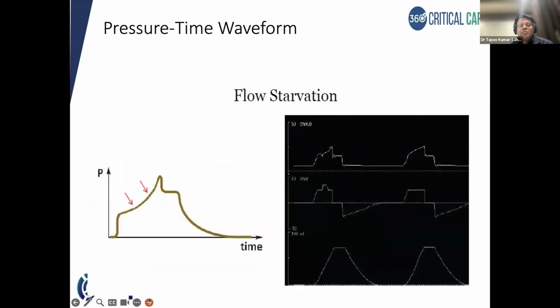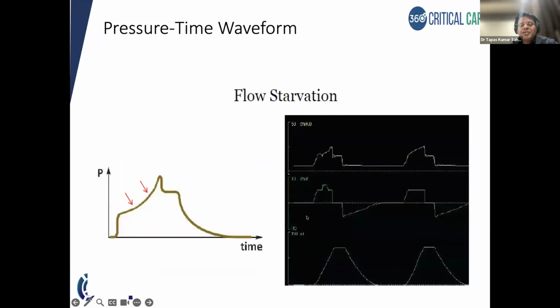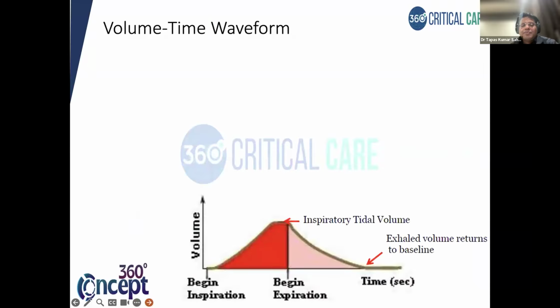Clear? Now coming to the pressure time waveform, if you are getting this type of waveform in the pressure time, what is happening here? You're actually seeing flow starvation happening. So flow is not adequate. So you have to increase the flow to reach the expectation of the patient. Otherwise this flow starvation would be happening. This is like something scooping. Okay.